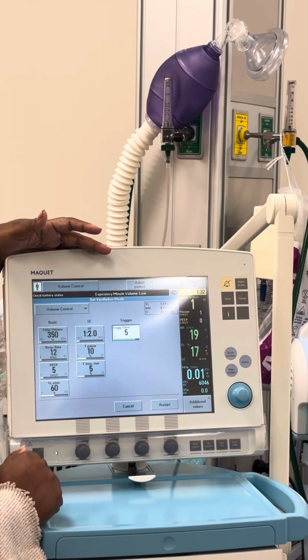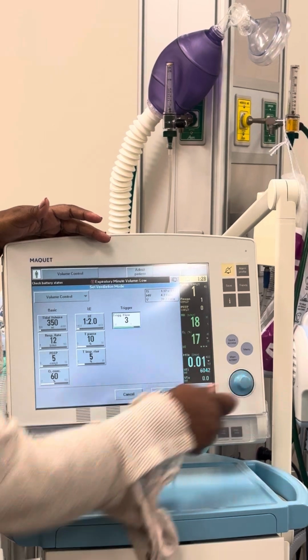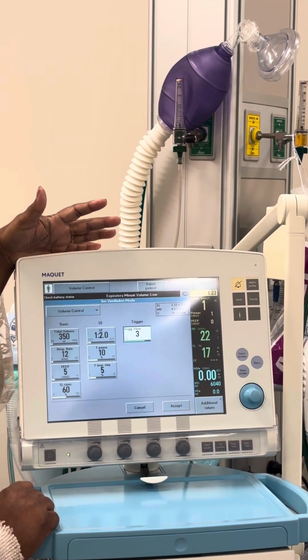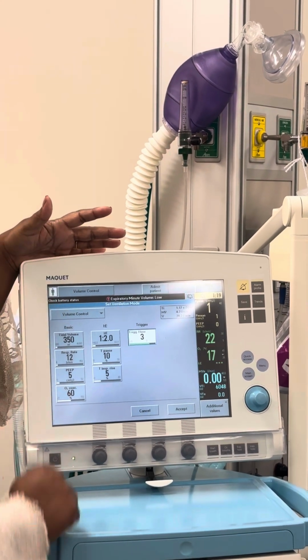2 to 3. 2 to 3. Where do y'all want it? I think she likes it at 3. So we'll stay with her. Say 3. All right, that's your flow trigger. Now also you have what else over there? On the other ventilator, where did y'all set?